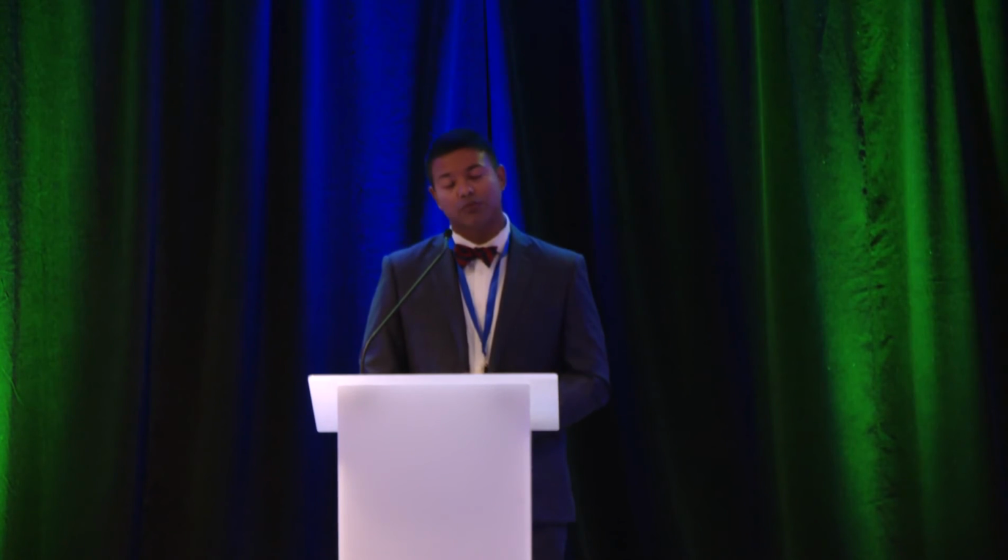So to end with a few special considerations for the study, thermal compensation. Because the catheter is calibrated prior to the procedure at room temperature, but the study is conducted and pressures are recorded at body temperature, there can be differences between reported and recorded pressures. So our solutions to this include intermittent calibration of the manometry catheter in a water bath that's at body temperature. Also, a thermal compensation maneuver after each study.